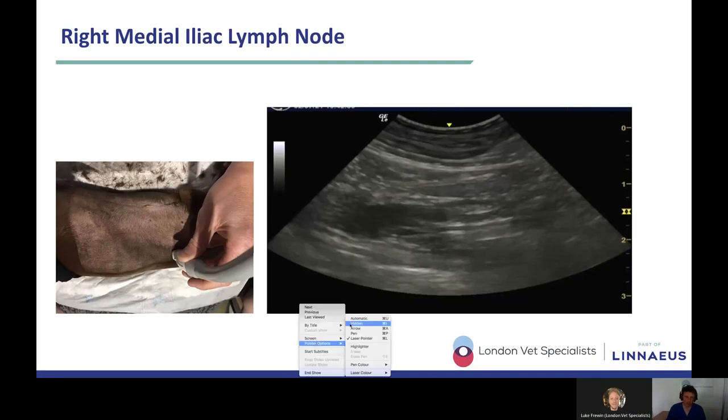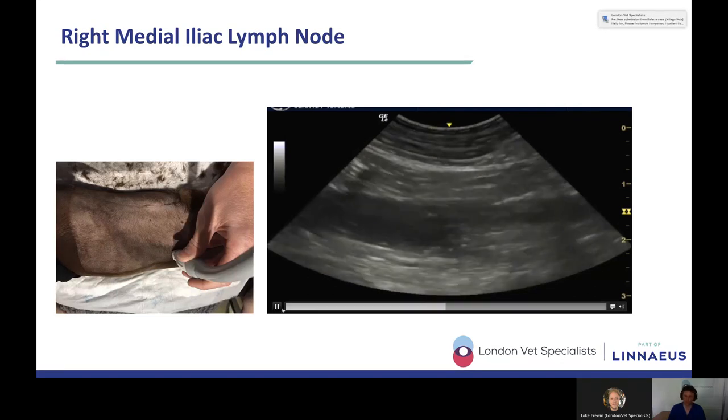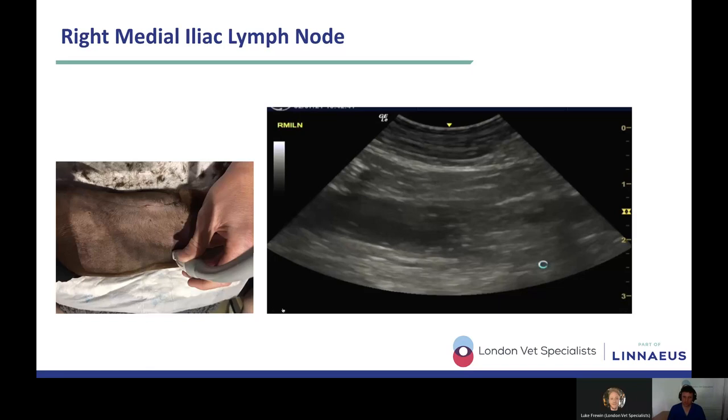Again, don't be disappointed if you struggle to find these lymph nodes initially. Just get used to developing that muscle memory, finding the aorta, finding the bifurcation, and fanning dorsally and ventrally around the bifurcation, looking for those lymph nodes. The more you do it, the more you will see them, the more likely it'll be that you will see abnormal lymph nodes as and when they occur. That's what they look like. So they look kind of sausage-shaped.